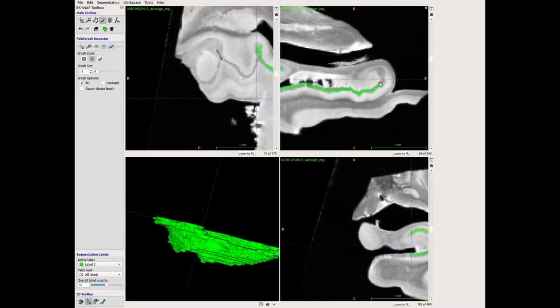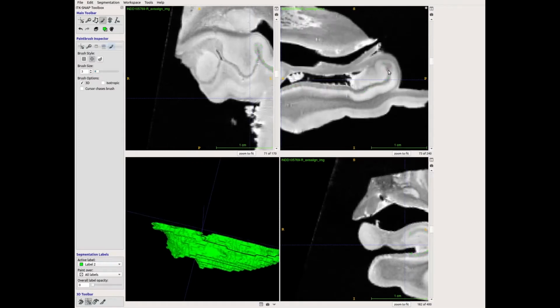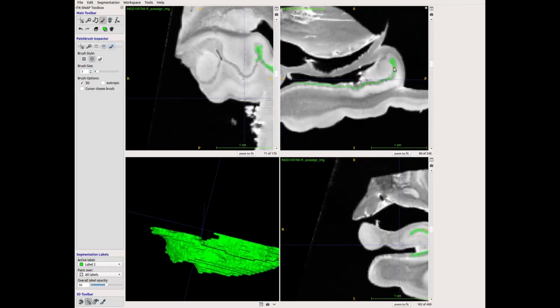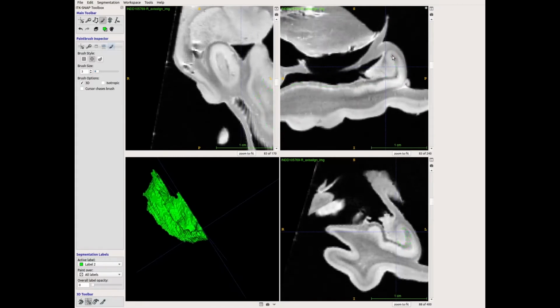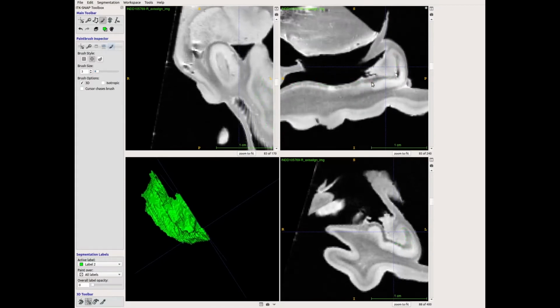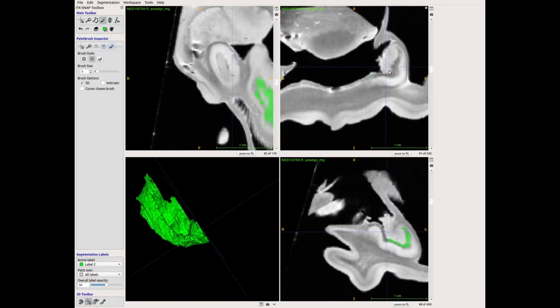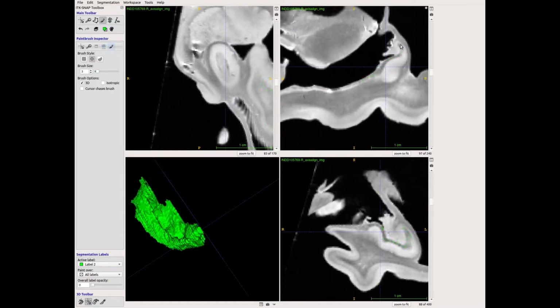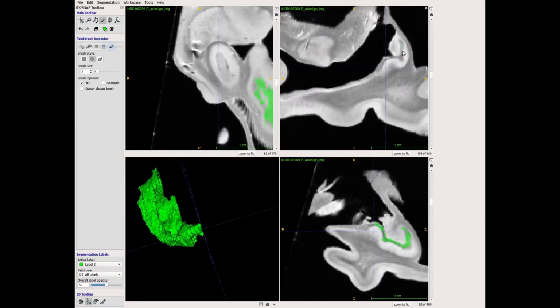a few reasons. So one is, it's just a really, really clear image. So I think this is a good learning case for anybody who wants to do this kind of manual segmentation in MRI. This should give you a good idea of what the anatomical ground truth should be. Oftentimes you will find that these images are not nearly as clear when you do in vivo scanning. With lower resolutions, you'll get things like partial voluming, and so you'll have all different structures sort of blurring together. But this should just give you an idea, ideally, of how this protocol should be used and what structures you should hope to see. So I'll just walk you through exactly what I'm doing here.